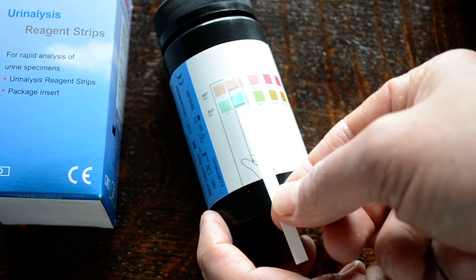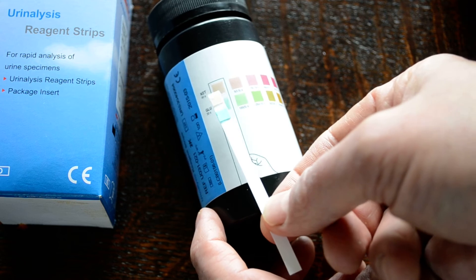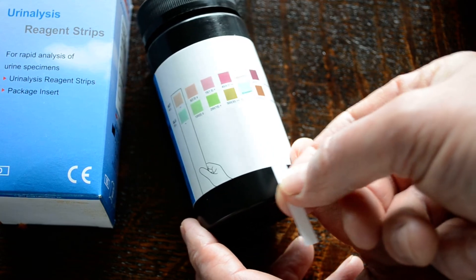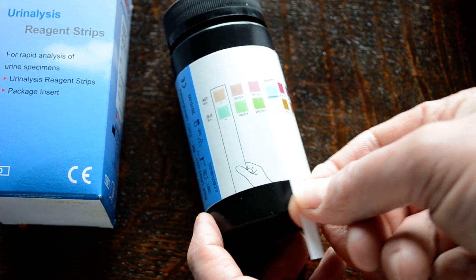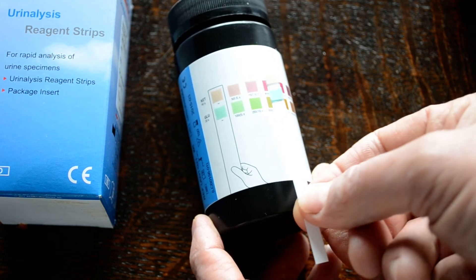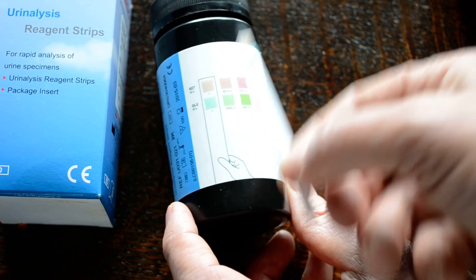Coming in at 30 seconds, you can see there's been no green or brown change on the glucose test, indicating an all-negative, clear sample. And with the ketone at 10 seconds later, there's no purple to brown discoloration — again matching the all-negative. You read these tests by matching the color change on the pad to the nearest corresponding color on the side of the test pot at the indicative test times.